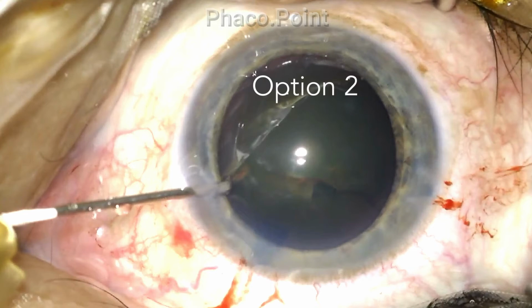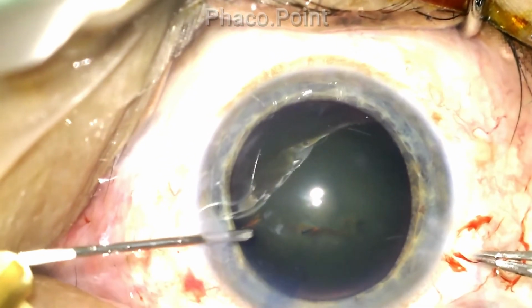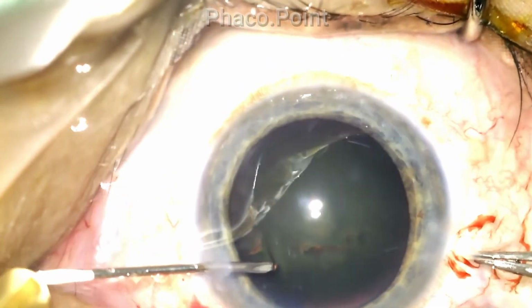Another option would be the introduction of an intraocular forceps from the right side to hold on to the raised flap and to propagate the tear. You will now see how I use the cystotome to propagate the capsulorrhexis further.